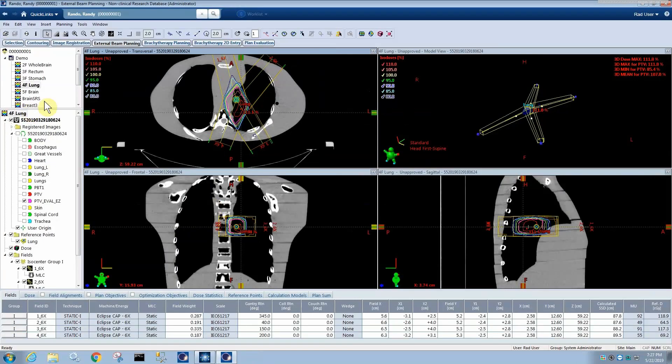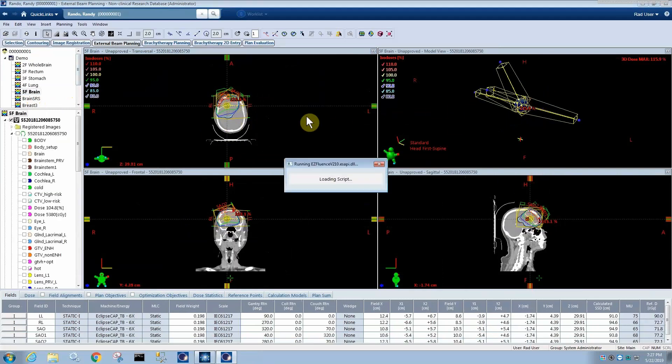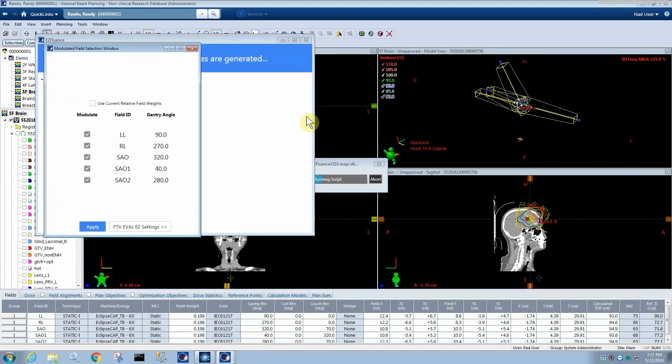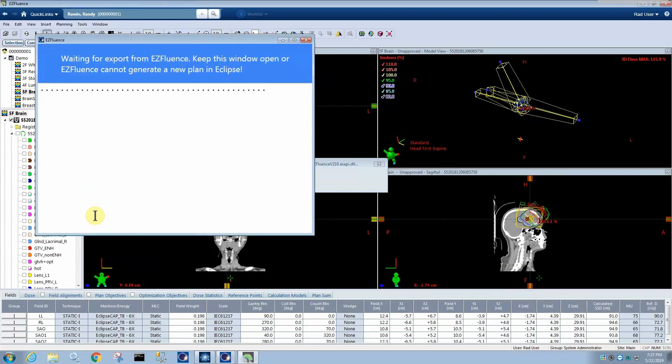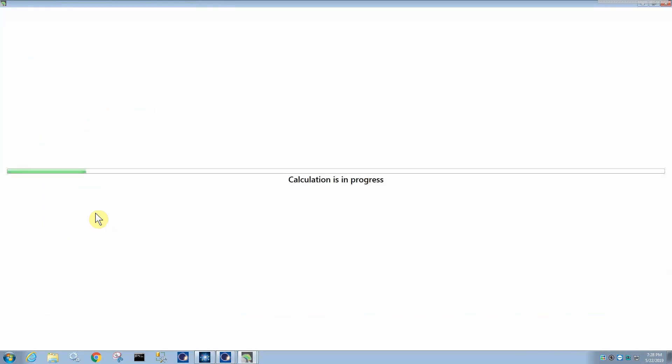So back here in Eclipse, one more thing I can show you, EasyFluence does work with any number of beam angles and couch kicks and so forth. So this is a five-field brain with couch kicks. So EasyFluence will, of course, prompt you like it did before if you want to use the current relative field weights or automatically select them. So I leave it unchecked to automatically select it. I'm going to have all fields modulated. You could decide to only modulate two or three and you'd probably get a really good plan because as long as they're ones that are good gantry angles to modulate from, then EasyFluence will use that modulation to fill in wherever the open fields weren't able to get coverage.